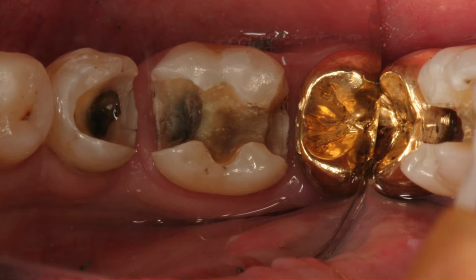And you're looking at this now, and you're probably thinking that you might want to build that up. If you look at that first molar, by the time you're done prepping that, what would you have left if you didn't build it up? Right. Your retention resistance form is going to be really poor, and your contours are not going to be good. So it's going to be tough to scan well. And the buccal and lingual walls are going to be very thin. I'd be worried about that as well.